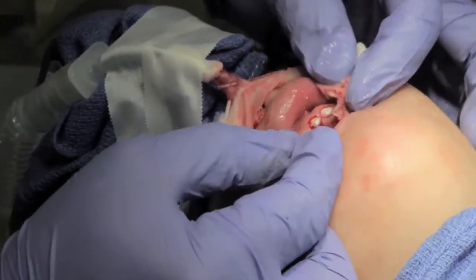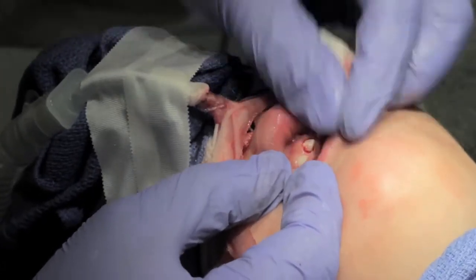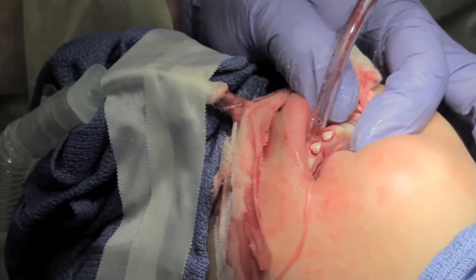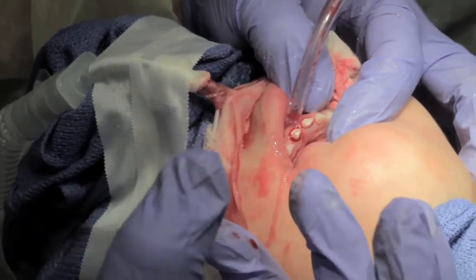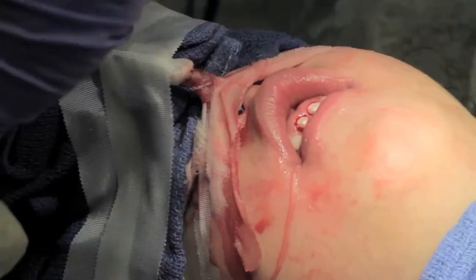So those are essentially the finished preps with the pulpectomies. You want to make sure everything is round. You want your prep to go subgingival so that the crowns will go subgingival. The biggest mistake people make is not being aggressive enough with their preps, and then the crowns are too big. Let's try them on one last time and then we'll cement.